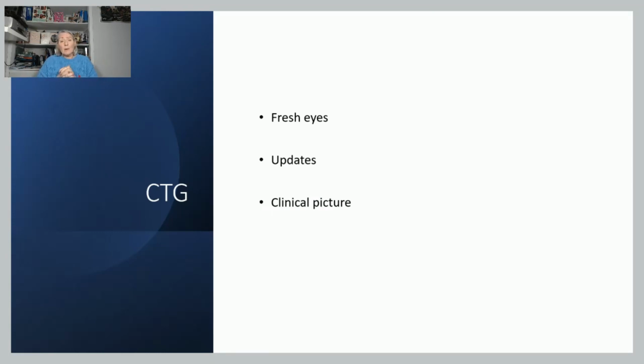It is about her or him looking at it with a fresh pair of eyes. You can become quite blinkered, particularly when you're looking after somebody for quite a long time. And if someone says, oh, could you come and do a fresh eyes on my CTG? It's fine, it's normal. I might already be thinking, oh, there's not a problem with that CTG. I may not actually notice because I'm already predisposed to thinking it's a normal CTG.